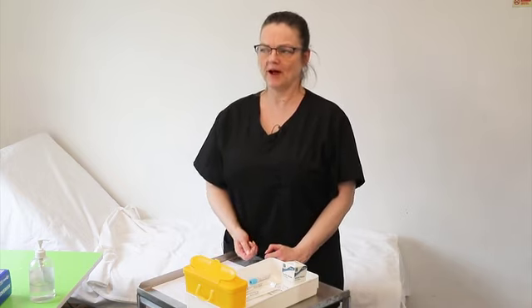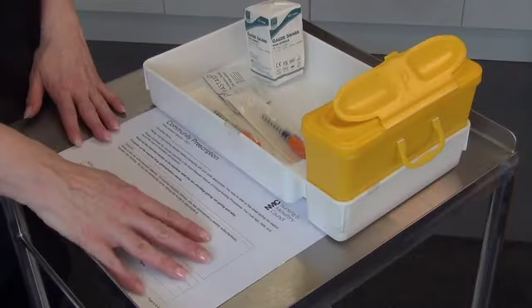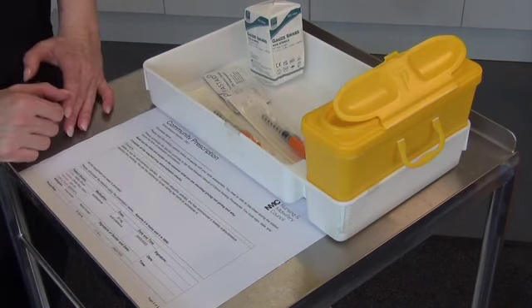So now we will prepare the medication. The examiner will also explain to you that although I am not preparing this medication with you, I would like you to show me your injection prior to you giving it. In the community, we don't check insulin as a rule, as a double check, unless in your place of work that is in the protocol, a drug administration protocol. But in hospital, we normally do double check insulin. But in a community setting, and we're being told this is a community setting, we're not going to double check insulin. And so the examiner is just basically saying to you, I want to see how much that you've drawn up.